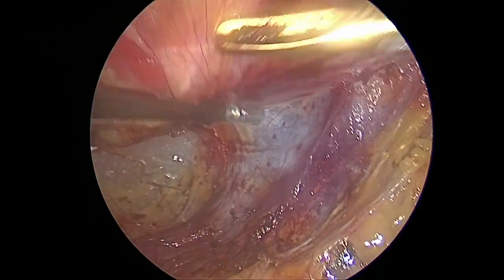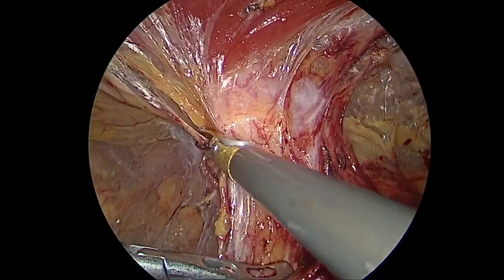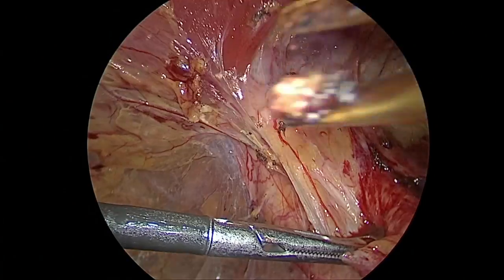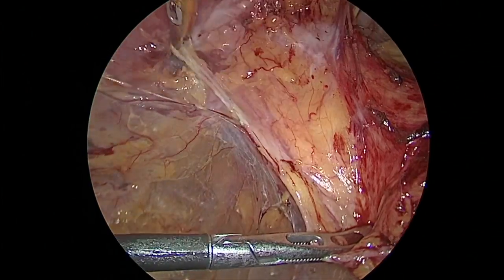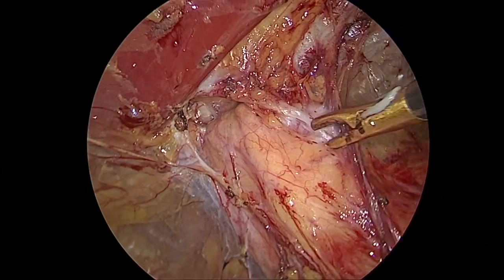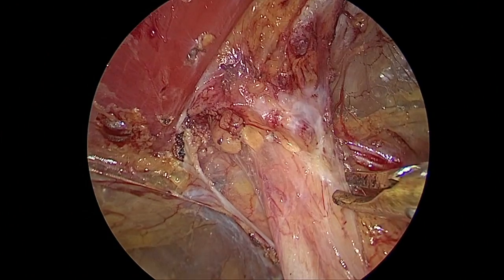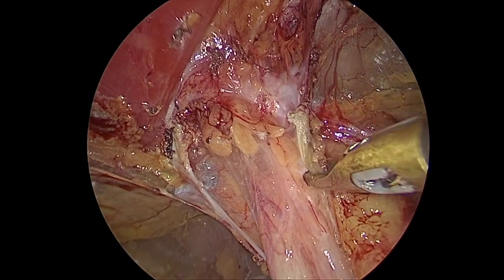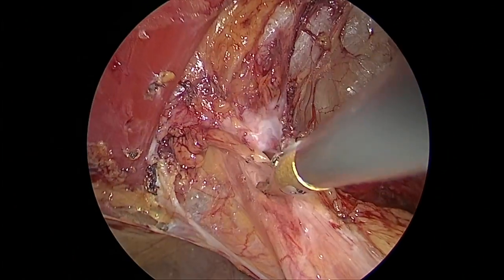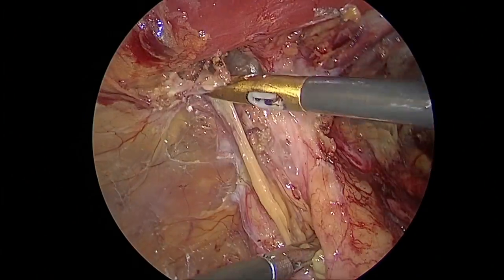So now what we have done is we have dissected the space on the left side of the screen which goes to the Cooper's ligament, on the right side which goes towards the Bogros space, and we have the hernia lying in between. If you are in the right plane, you can dissect the sac very easily, push it superiorly, and then lead to reduction of the sac.